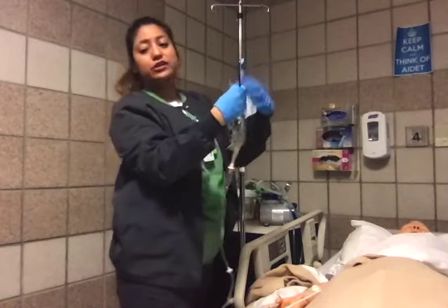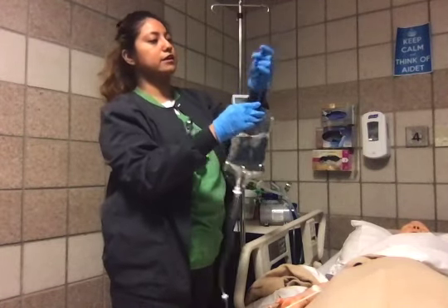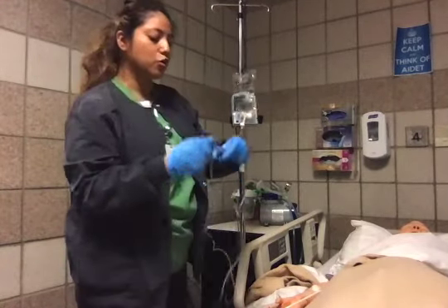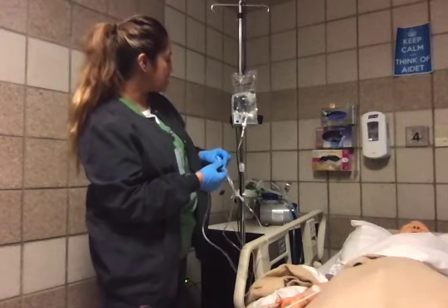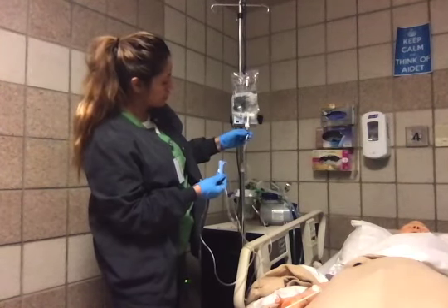This hanger came in my secondary tubing bag, so I'm just going to hang it in the hanger. And we're going to open the tube, unclamp it, because we want to make sure that it's flowing. So we're going to fill this chamber.